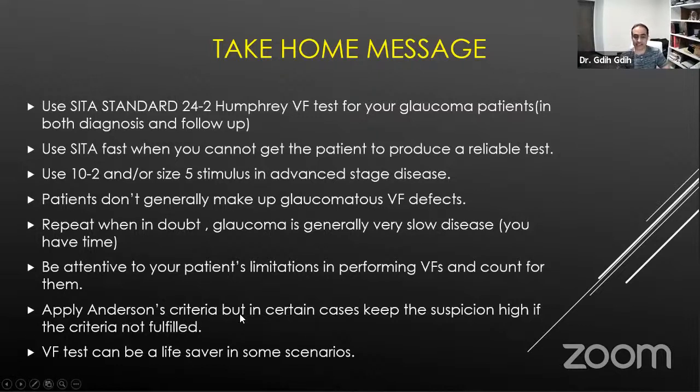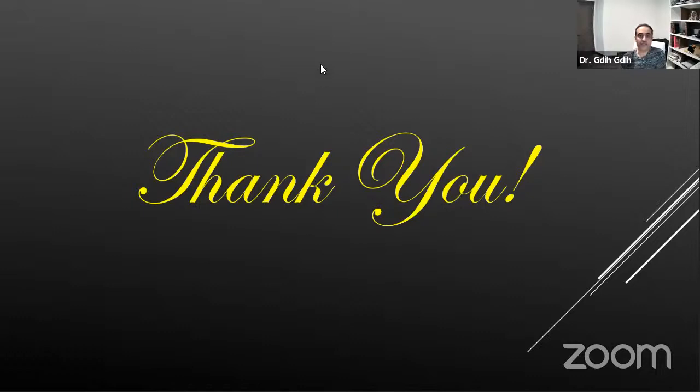Apply the Anderson criteria, but in certain cases, keep the suspicion high if the criteria are not fulfilled. Again, I told you, this lecture is meant to read the glaucomatous visual field. It's not meant to make a diagnosis of glaucoma or not, because you could have glaucoma with a completely normal field. A visual field test can be a lifesaver in some scenarios, like this lady that I presented with a macroadenoma. Thank you very much, and I welcome any questions.